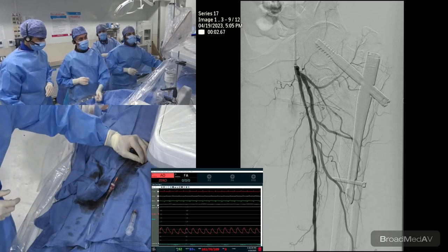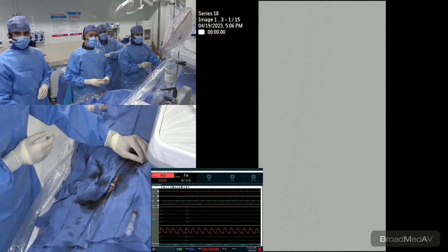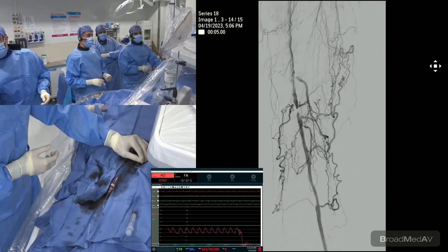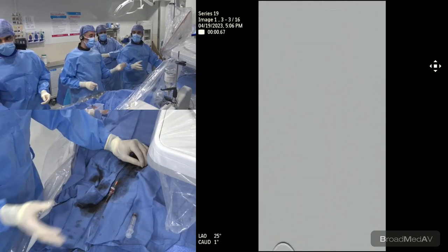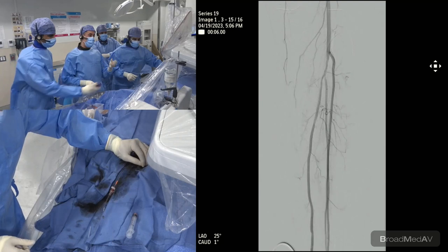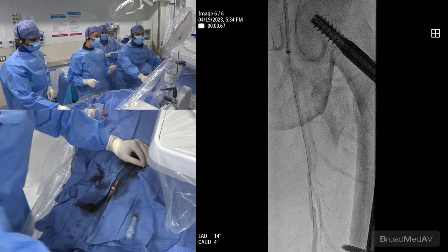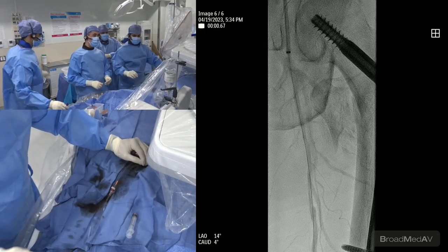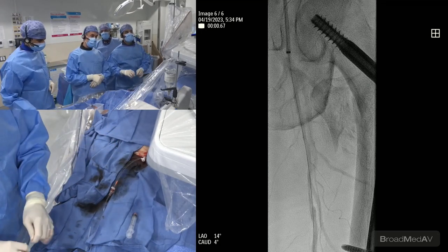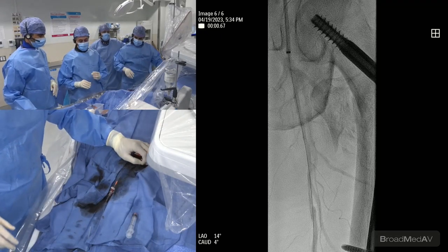Michelle, can you expand on the effect of recoil on DCB and some of the work that we've done here at Sinai? We actually published, with PK as the lead author, in JACC regarding the mechanism of failure of DCBs, and how they work. One of the mechanisms, like you talked about, is recoil. In this case, because it's a focal lesion, if you just balloon it, the probability of higher patency is much greater compared to longer lesions, calcified lesions, and those with significant poor outflow. The significant predictor of restenosis with DCB is going to be recoil. So here you have recoil and dissection.